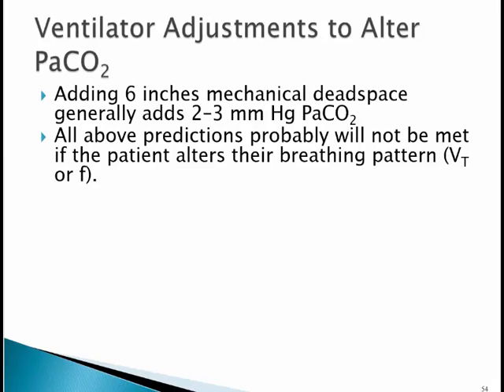If the problem states that you have dead space in the circuitry, then the first thing you do to adjust it is remove the dead space before you adjust the tidal volume or respiratory rate. So in the priority of things, it's the dead space, then the respiratory rate, and then the tidal volume. But the dead space there, and they'll point it out if it's there. If they don't point it out, don't read more into it than you need to. But initially, adjust the dead space.